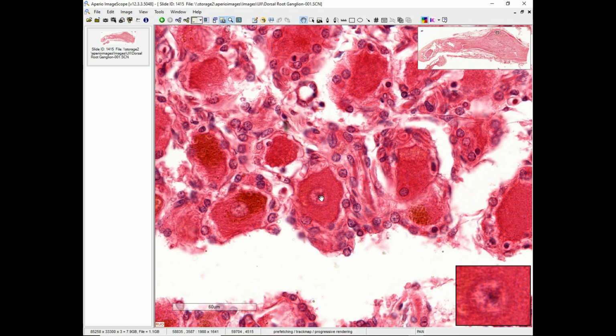Now to zoom back down here, you can see that the nucleus has a darker area inside of it. This is going to be the nucleolus. The nucleolus, having that large dense area, means that there's also areas of DNA that are unraveled that's making it transcriptionally and translationally active. So this is a nerve cell that's producing a lot of protein, or in this case, likely neurotransmitters that are going down the axon to let the neuron do its job.